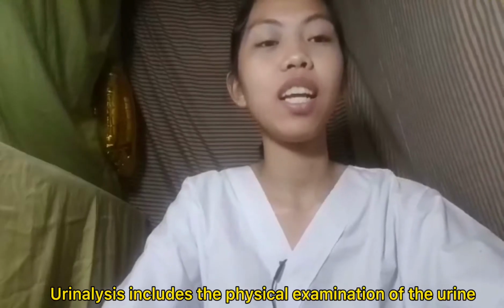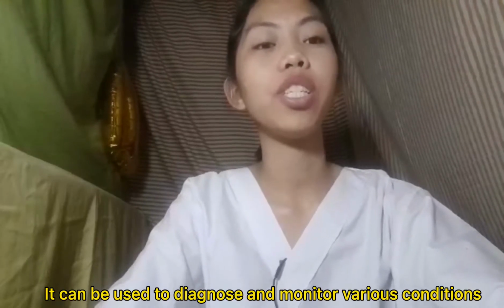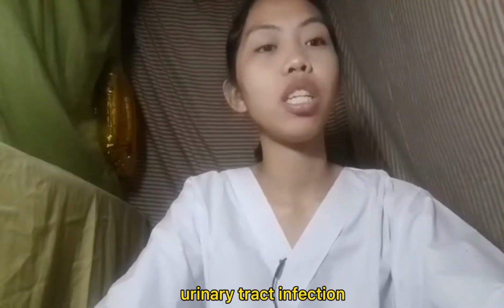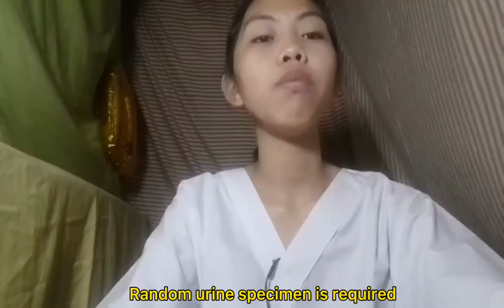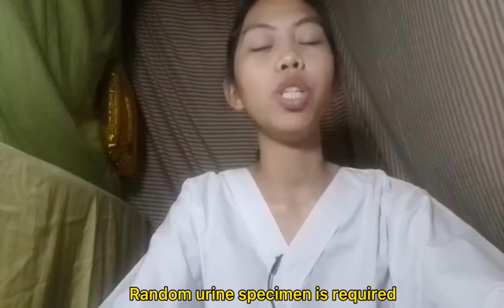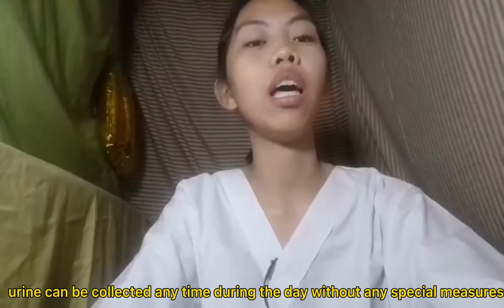Urinalysis includes physical examination of the urine, testing of urine, and examination of the urine under a microscope. It can be used to diagnose and monitor various conditions, including kidney disorders, urinary tract infections or UTI, and systemic diseases such as diabetes. Now, for the routine urinalysis, a random urine specimen is required, which means that urine can be collected anytime during the day without any special measures.